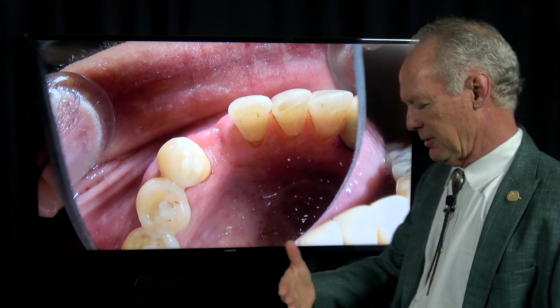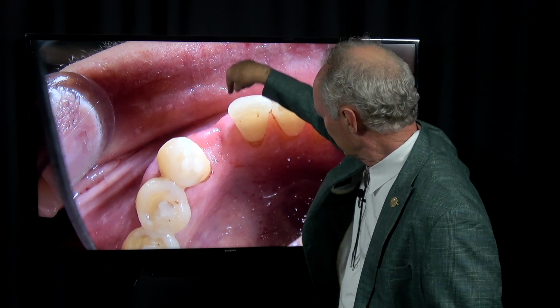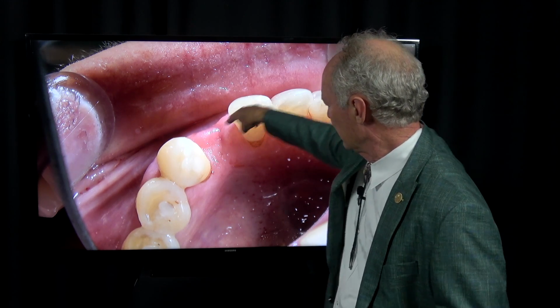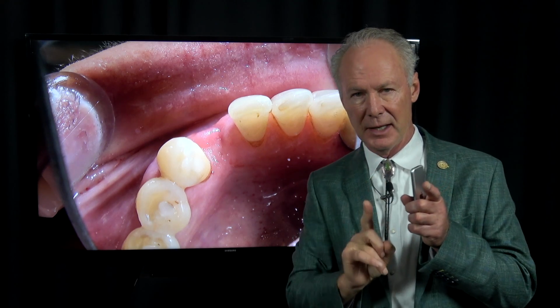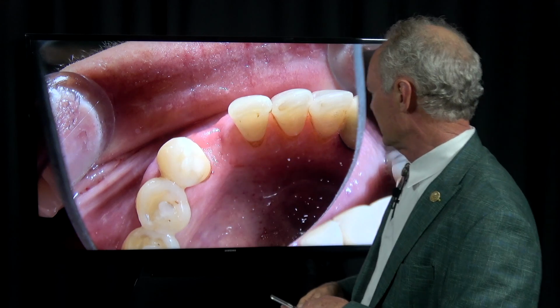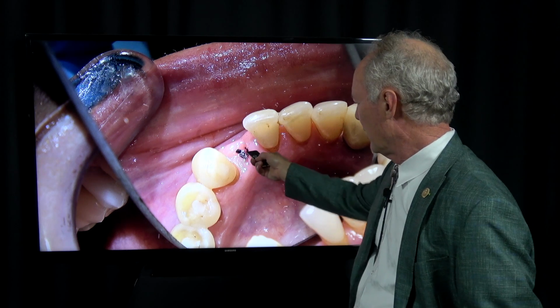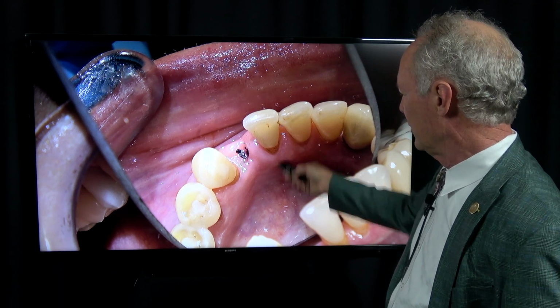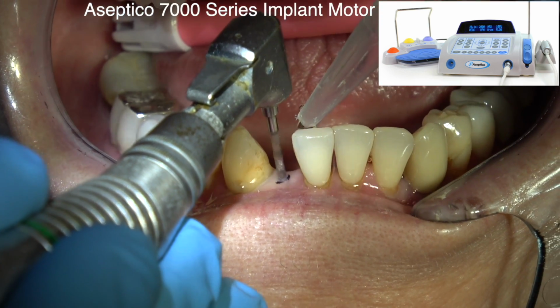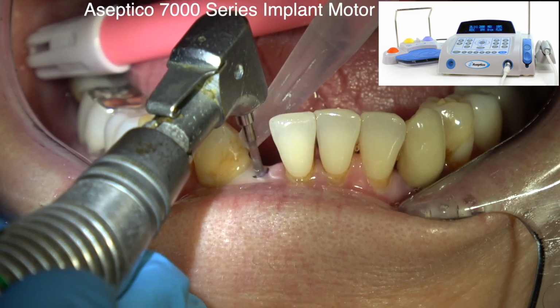And I use a large occlusal mirror, and I'm always looking from the incisal, so I can see that my direction is in alignment with the adjacent teeth, and I'm always looking at it from the facial to be sure it's not this way or this way, that it's lined up straight between these two teeth. You don't want to place the implant obviously into an adjacent tooth. So I'm marking the center of the socket, or the extraction site, with this magic marker, just to be sure that I'm right in the center. Then I'm going to be careful to line the pilot drill with the adjacent teeth.